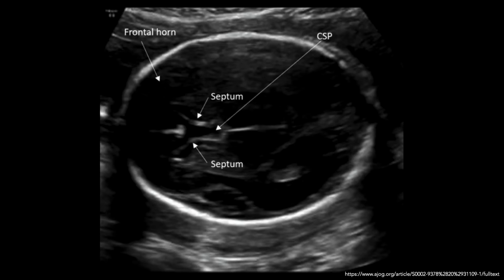The way I've always looked for it is you look for the arrow sign, right? If you imagine a little arrow, and I'm just going to put it right there for you, the posterior aspect of the thalamus plus the midline equals an arrow that points to the posterior portion of the head. If you see that little cavum septum pellucidum, the thalamus, that arrow sign, you're in the right spot, the right level to make this measurement for the fetal biometrics. And you really want to avoid including the cerebellum. You want the triangulation of these different structures, right?